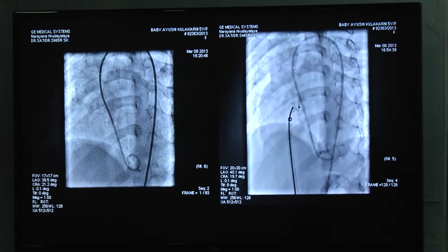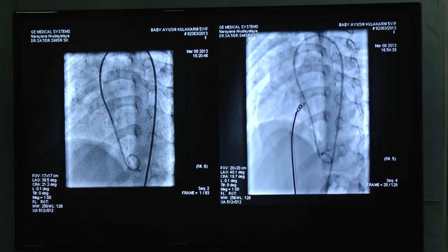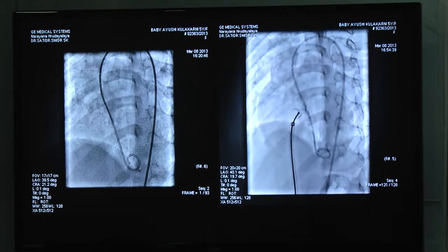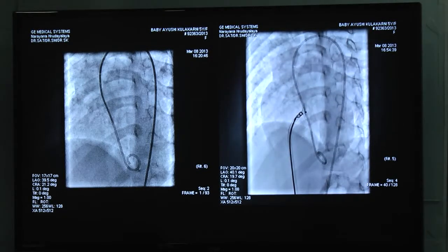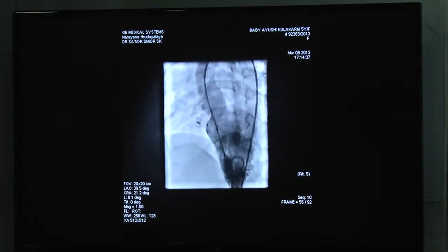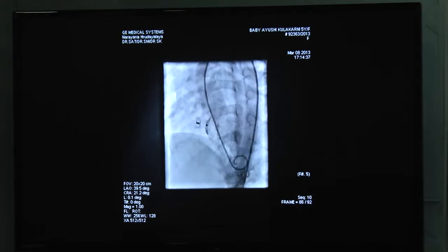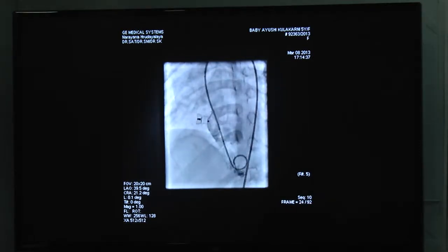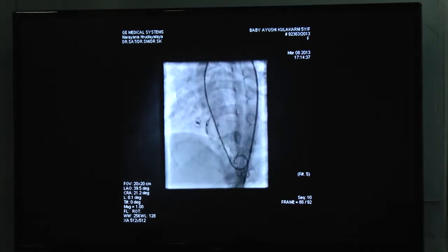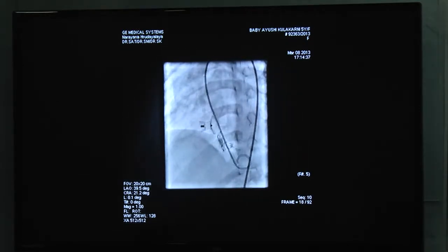You can see that we are releasing the second disc. We have the pigtail catheter in the left ventricle, and this is, we do it percutaneously. So again, in most of the centers, they do it under TE guidance. We have done a lot, so we are not doing it under the TE guidance anymore. And then you do the angiogram, you see the hole is completely closed. Okay, so the percutaneous device, we have done about 450 VSD devices here in the last 7 years.